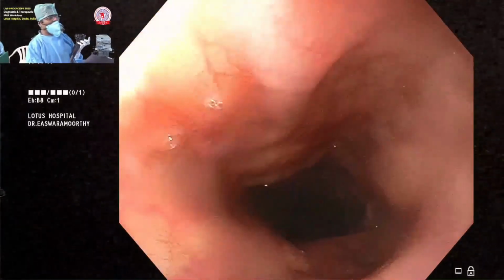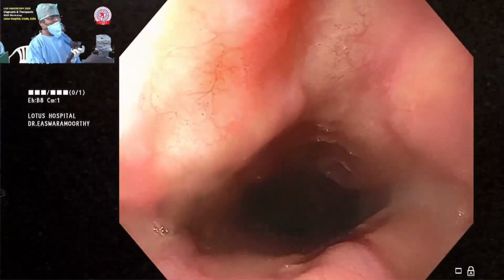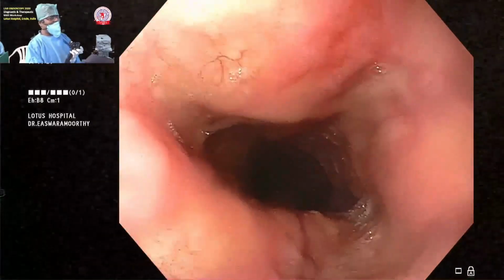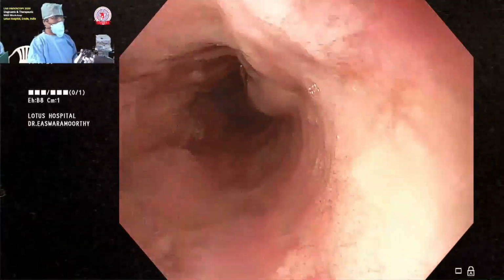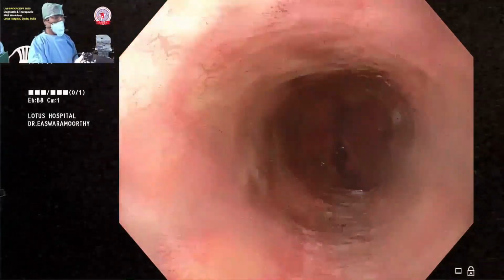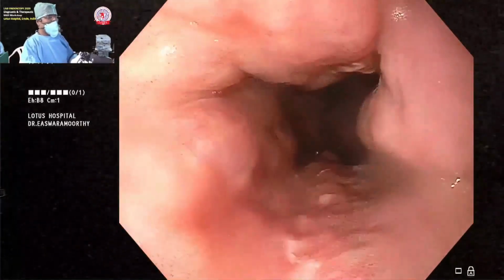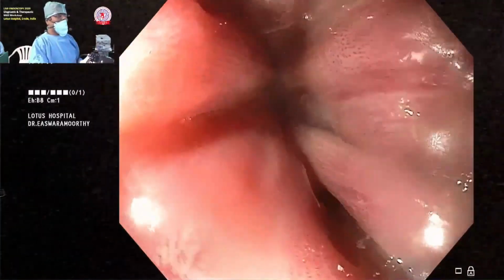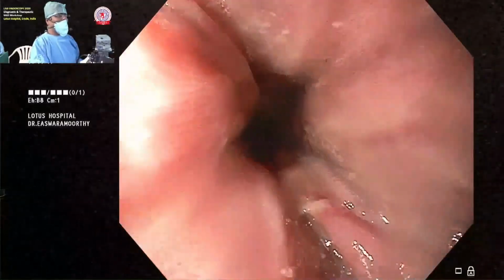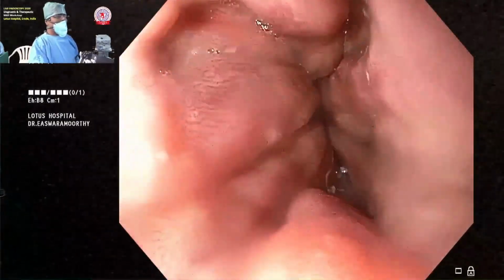You can always have a look here as we go. He is having in the esophagus momentarily small dilated veins which are grade 1 varices. As I said, our aim today is to teach you navigation, but there are pathologies here. There are at least 4 columns of dilated veins. They are between grade 1 to 2. Then say this is close to grade 2 or even 3 at some points. And also there are some other telltale evidence to say they need further treatment.